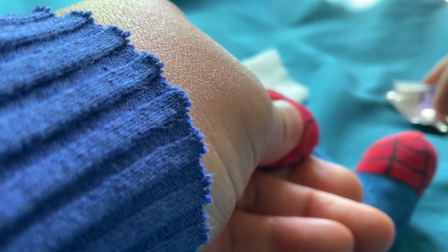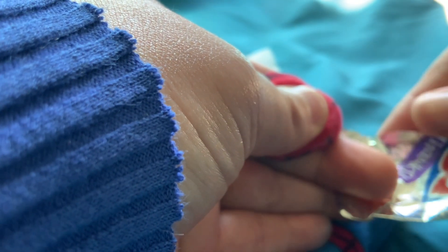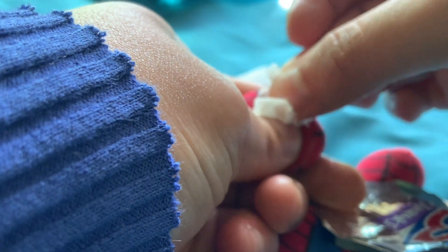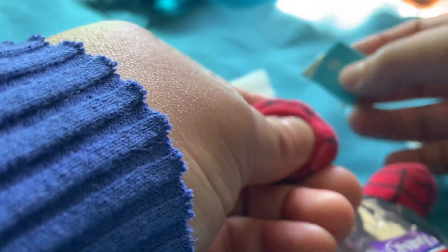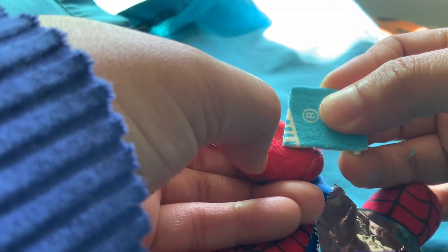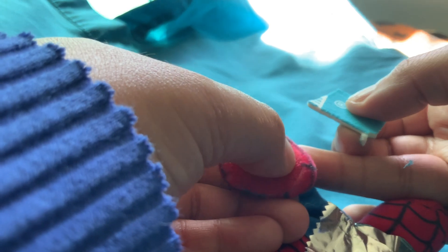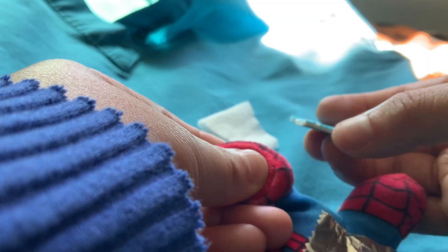I grab the alcohol — this is obviously paper, but I'm pretending — and I wipe and let it dry. I'm still holding right here with my thumb. So if you use this trick, you put your thumb right there on the off-limits area, and this is the area where you can safely poke.